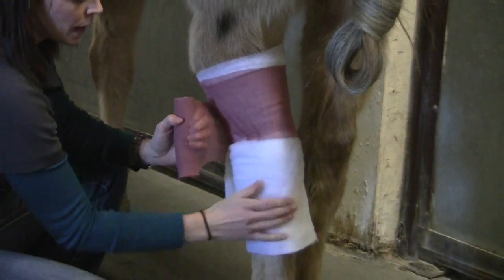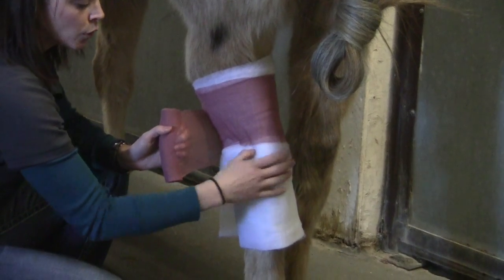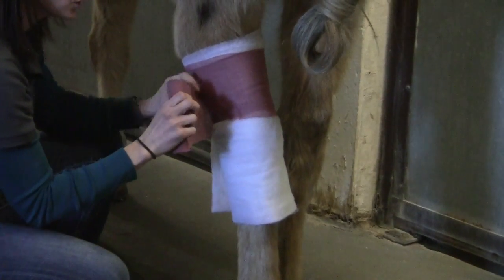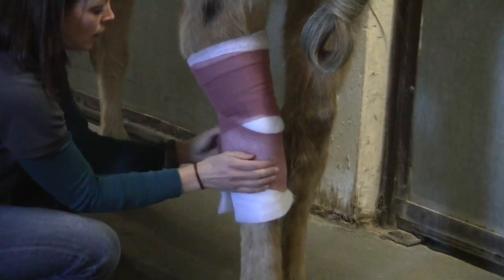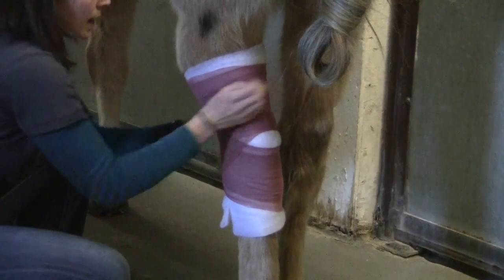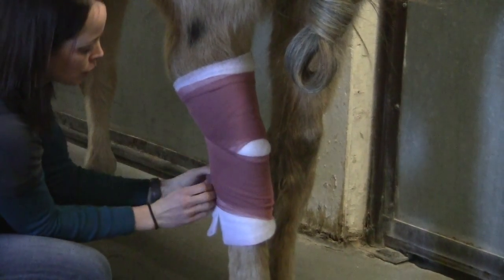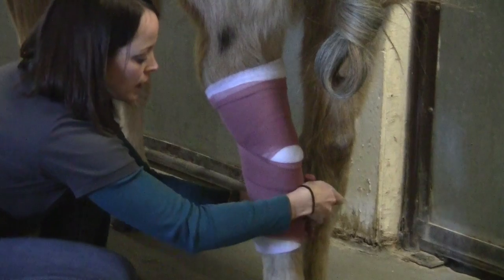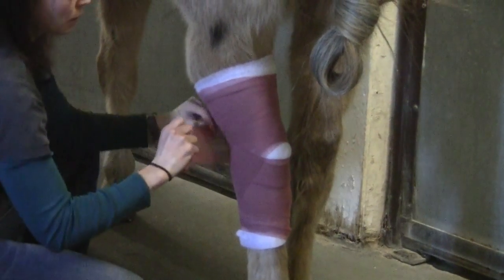As I get over the point of the hock I'm going to do what's called a modified figure eight, essentially trying to avoid putting any pressure over the point of the hock. If you do get pressure there it's not the end of the world, but I usually just take some scissors and cut it so there's no pressure right over that region. I come right down underneath the point of the hock, go around the layer, then come back up — creating a figure eight around the leg. I apply nice even pressure all the way down to the bottom of the cotton, then sneak back up above the point of the hock as I come back up the leg.